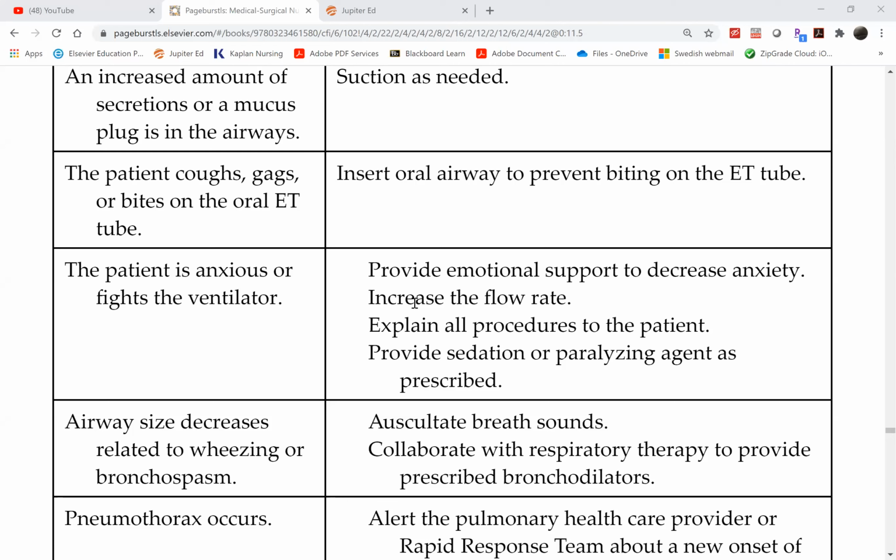For here, you have a pneumothorax now. So now you have a collapsed lung, and of course that will trigger great resistance. So the tidal volume cannot be delivered because there is now a collapsed lung. By how much it's collapsed, we don't know. And of course, the bigger the size of the pneumothorax, the smaller the area of expansion for the lung.